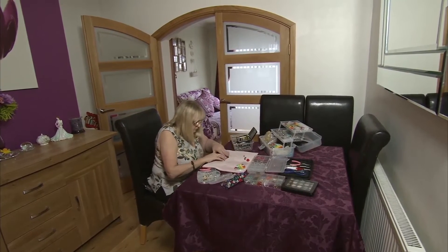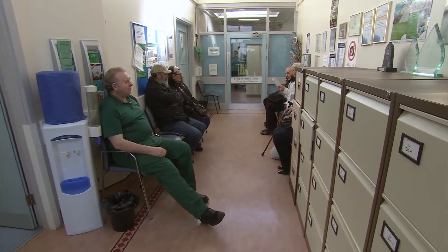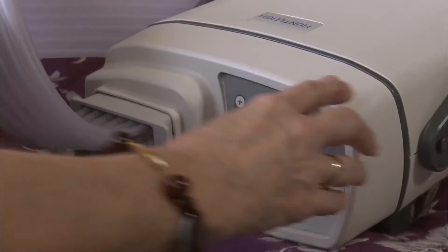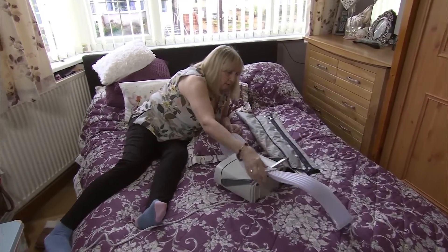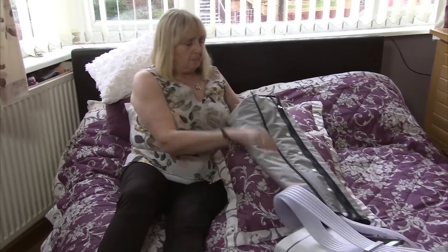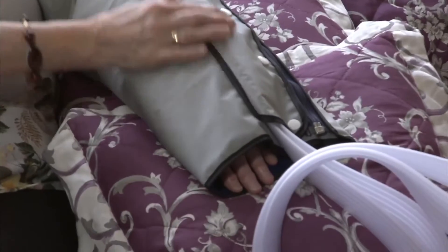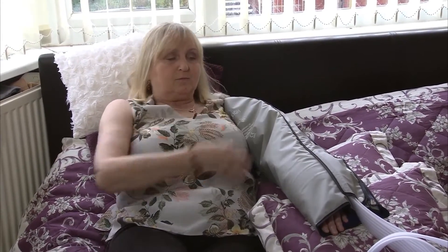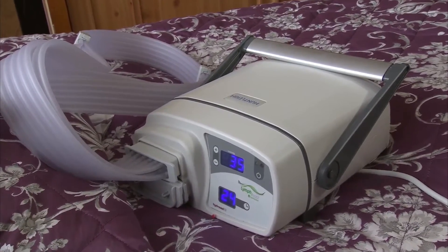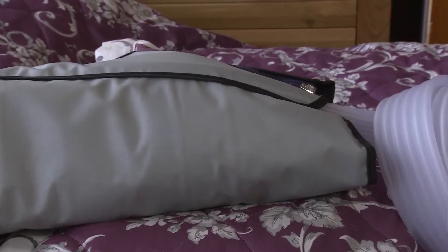When she was attending clinic for therapy, Sian found that a session on the machine helped to soften the tissues and reduce the swelling. They're available in all the NHS lymphedema services in Wales, but if you find them really helpful, you can buy one to use at home. It starts from my fingers to my hand and then works up — it's a gradual process. Now that I have the machine at home, I've built up to using it three times a week. They could do it every day as long as they didn't have any infections. If you've got any broken skin or any problems, that's what you've got to look out for.